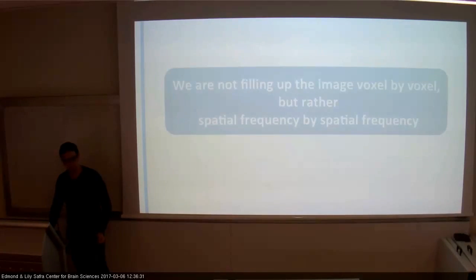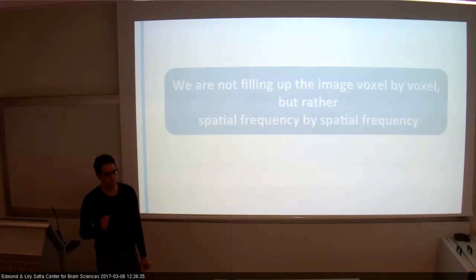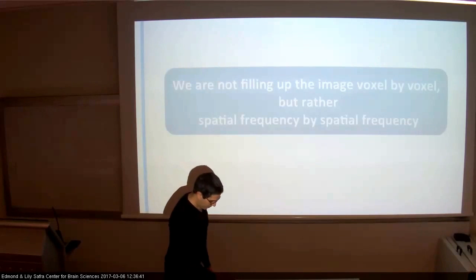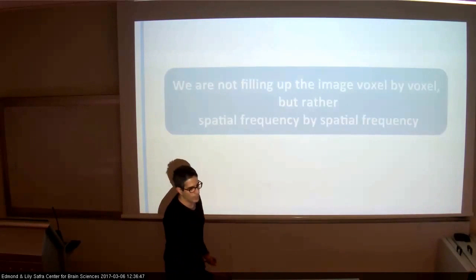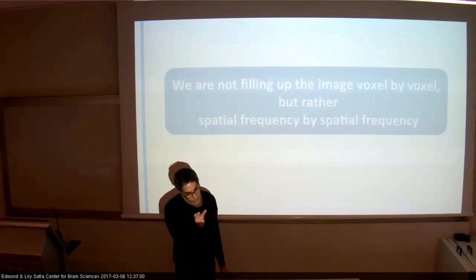How do you define what a slice is? You apply this gradient. So how do you know exactly? That's what I said: I try to describe everything as perfect, as if there are discrete frequencies in space and not a continuum, and I can excite at a very specific frequency and not in some range.